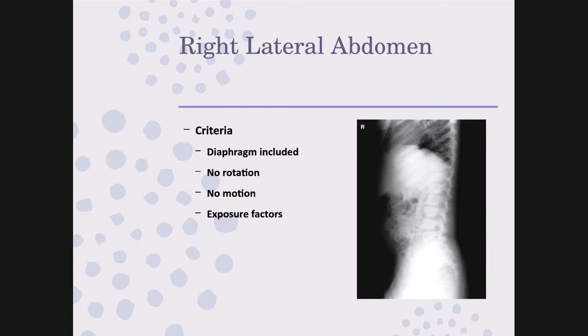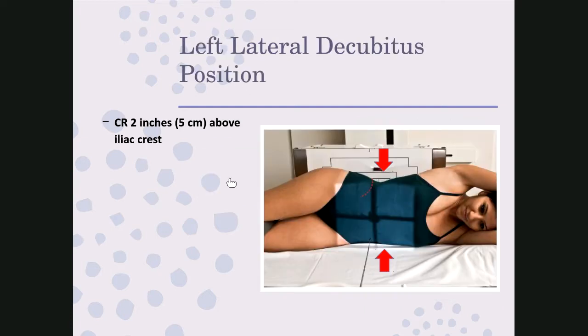Now, going back to, like we had discussed with an AP supine abdomen, if you went to your patient and they were not stenic, they were hyperstenic, and you had to do 2 IRs placed crosswise to each other, just like we did when we talked about the AP supine abdomen, what you would do on that is actually place your IR crosswise to the patient, okay, meaning it would be 17 this way and 14 over here.